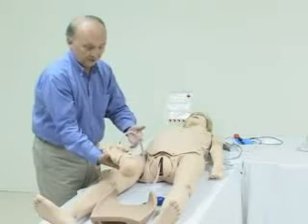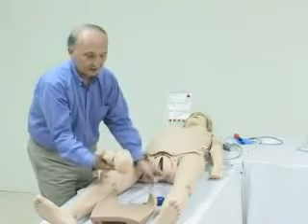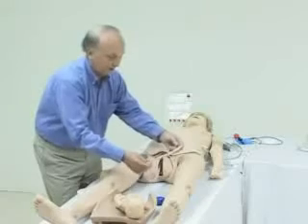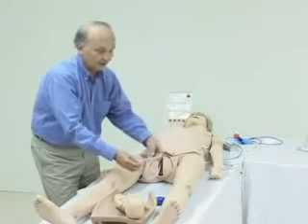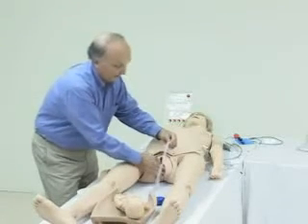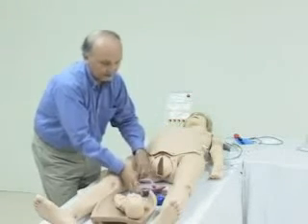Now that we've delivered the fetus, we can clamp and cut the cord and turn the child over to the resuscitation team. At this point, we can proceed with birthing the placenta, which could have been placed in a position where significant traction would have been required, or a rather easy birth is in order. In this case, I've elected to simply remove the placenta in the normal fashion.